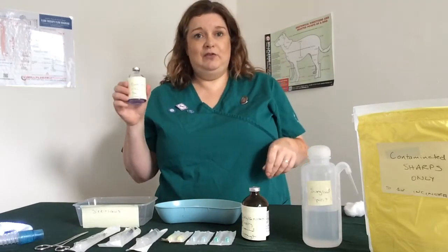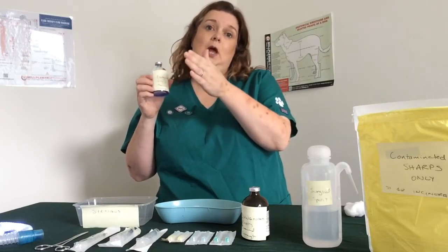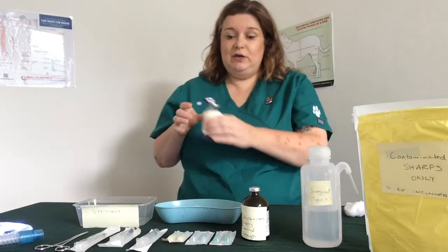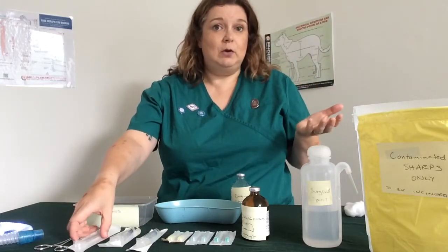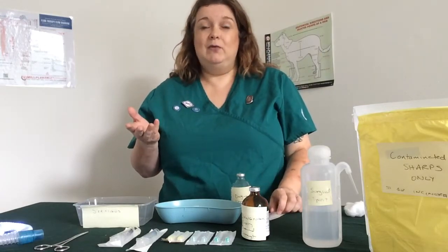So you've selected the correct drug, you've looked at your 4 points: you've got your drug, your expiry date, your broach date and you've got the right strength. Then you need to select your needle and syringe. So, to make it quick for you guys, I'm going to go for a 1 ml syringe, and that's going to be a small amount.